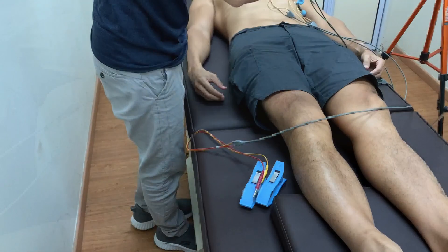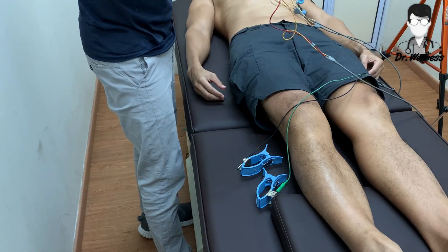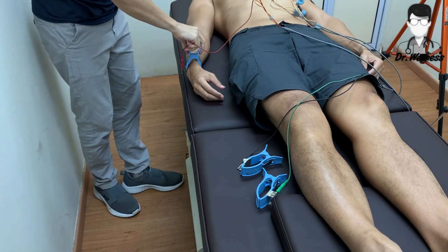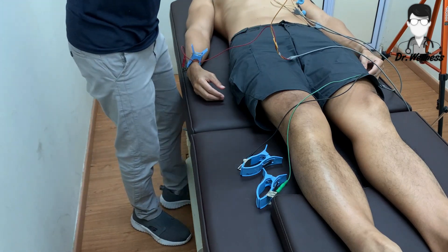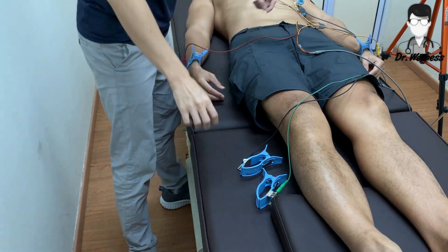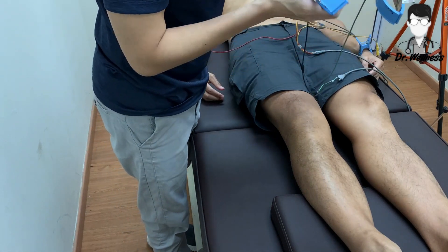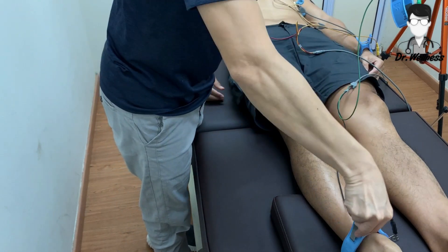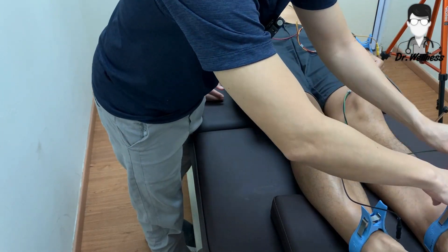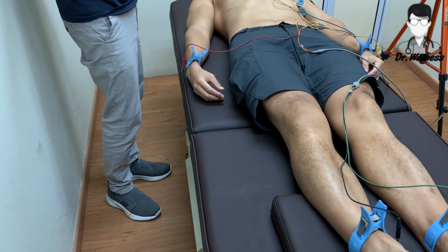Then now we will hook up the limb leads. One goes to the right hand, the other one goes to the left hand. And we have the leg leads — this is the right leg, and this is the left leg. With that, we have the setup of the ECG done already.